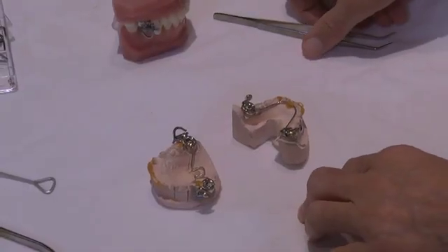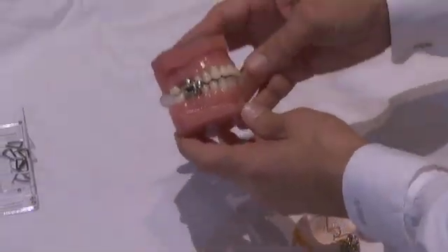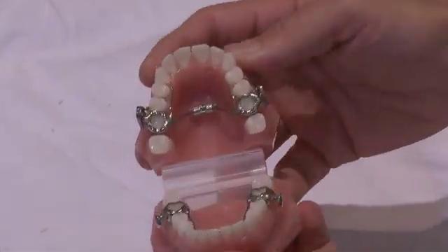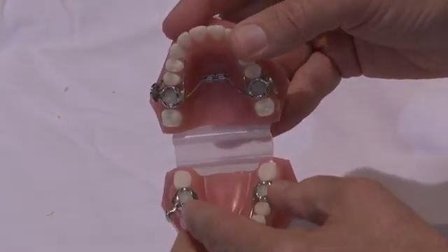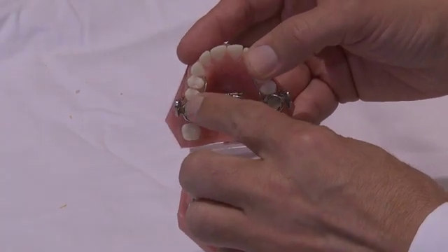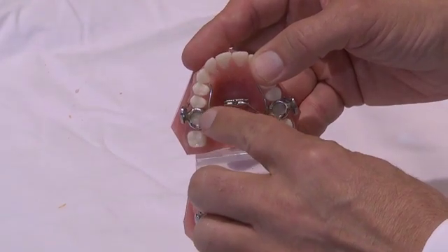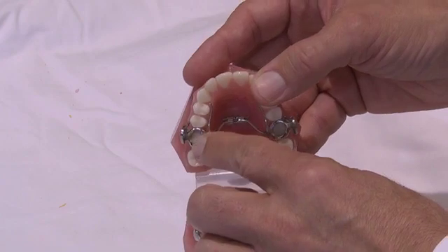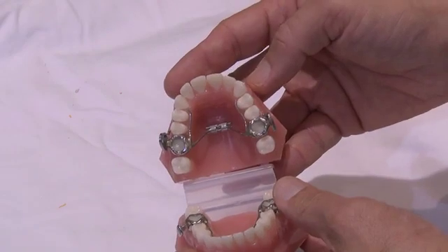Let's talk about the different parts of the MARA appliance. I'll start by showing you this typodont. If we open the typodont, this MARA design uses a stainless steel crown on the sixes, but what we call an egg shell crown, which means it's a crown that has been adjusted so that the occlusal component is removed. This makes it much easier to seat and doesn't have as much change on the vertical dimension.